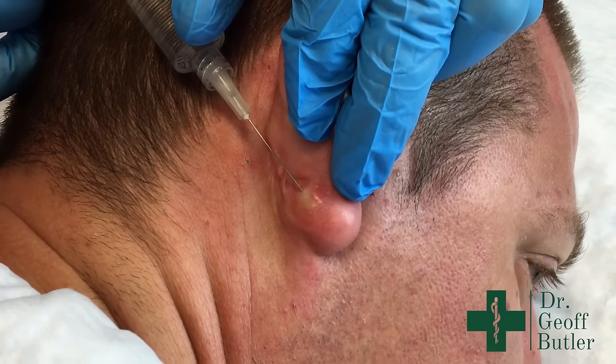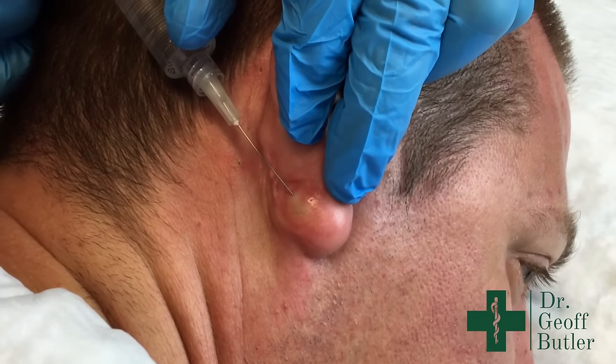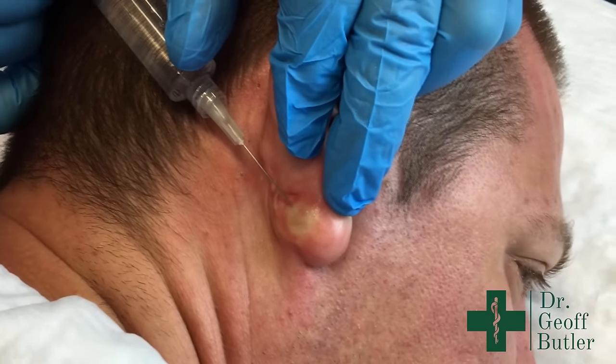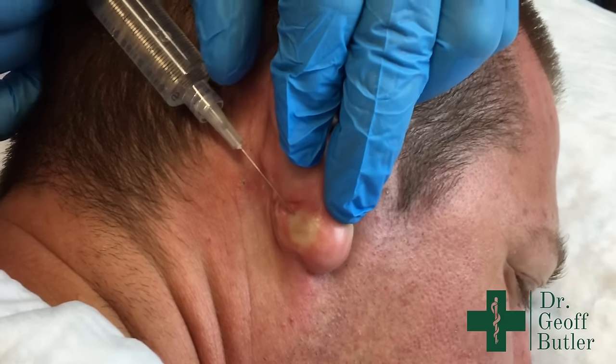Hopefully we won't need to do any packing. If it's cystic, we may have to collapse down some loculations. The lobule of the ear can be a decent third space and have that happen to it.